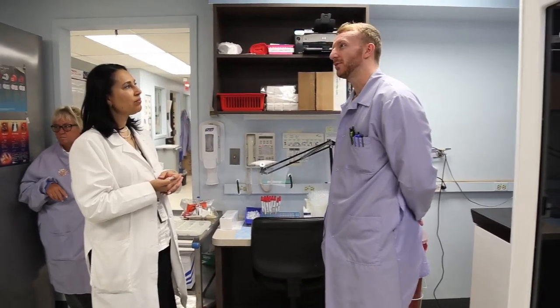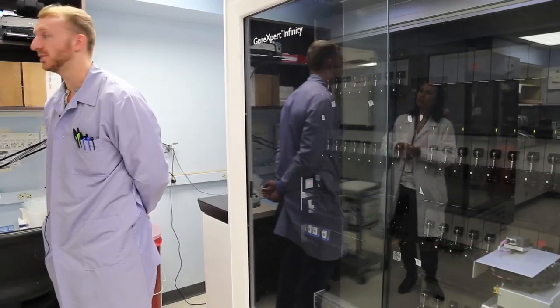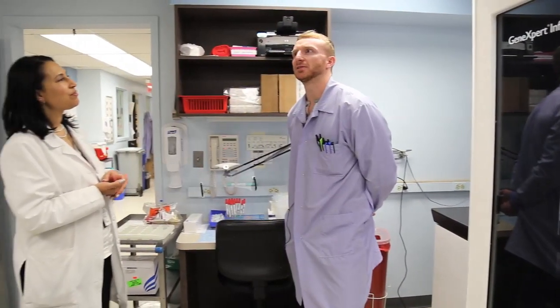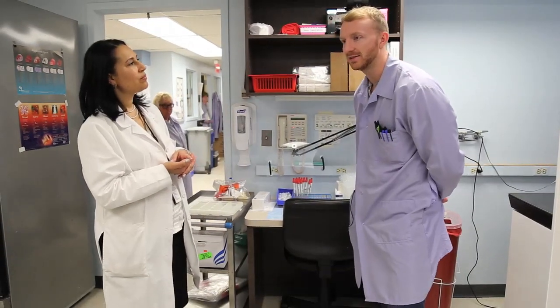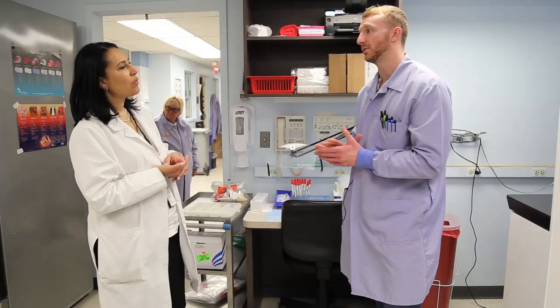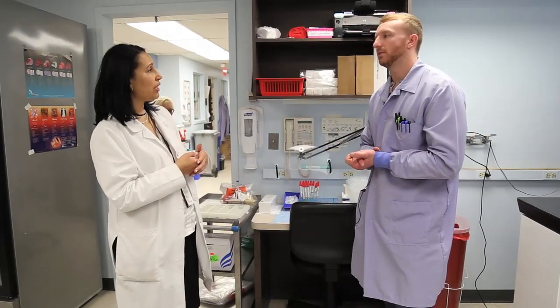and there are several different assays that can be run on it. There's C. diff, Group B strep, MRSA screen, the notorious MRSA screen. There's carbapenem resistant assays. There's rapid tuberculosis assays, and all of these assays come out with a result in about 1 hour. So it's very rapid. Okay, so this can be used for screening, maybe taking someone off of TB isolation earlier. Yep, that's correct. And you said strep?